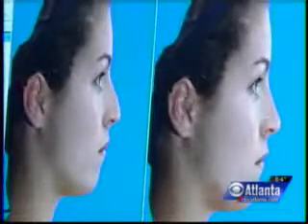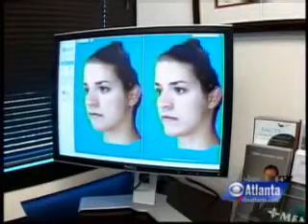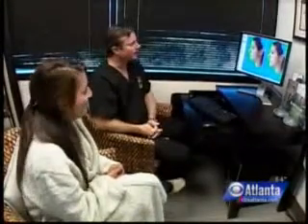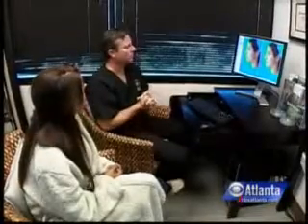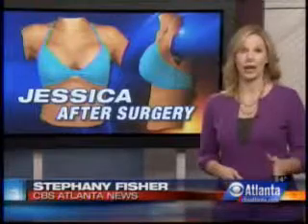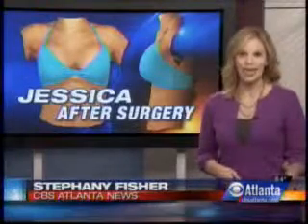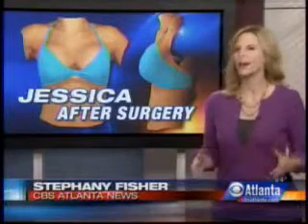I think it's more reassuring because you have more of a clear view of what you're going to come out like. It may be reassuring, but Connors says patients still need to be realistic about their results. It's not just the computer generating a result, it's actually me artistically saying this is what I'd like to present to you as a potential result, and knowing full well that there are no guarantees. Dr. Connors says the Vectra does not replace a full physical examination and personal consultation with each patient. He still takes measurements and uses this only as an added tool to help the patient visualize and then fine-tune their results.